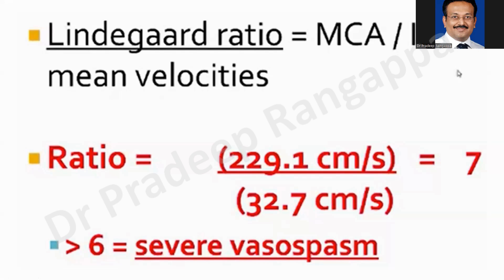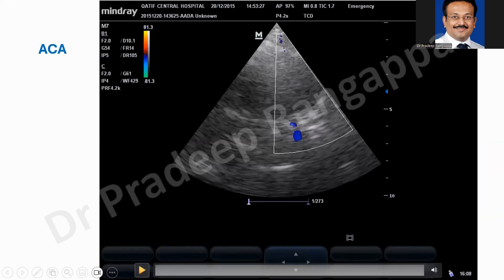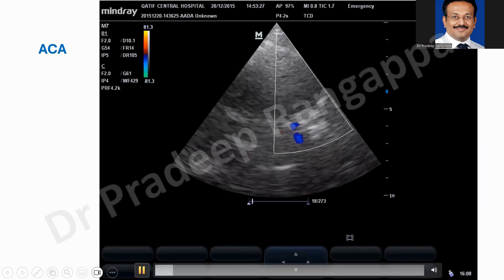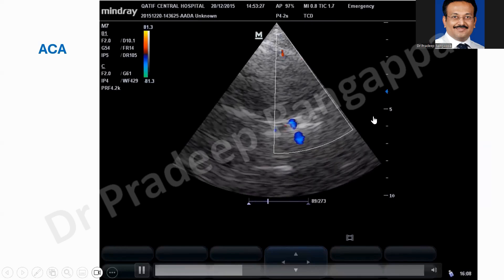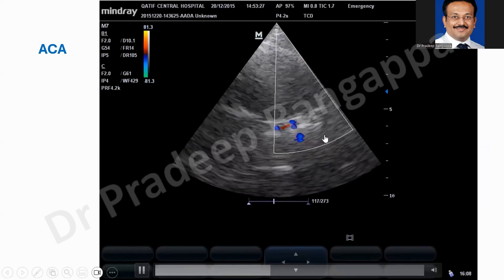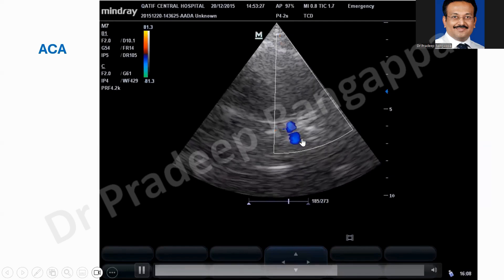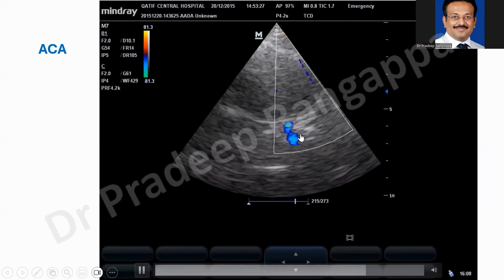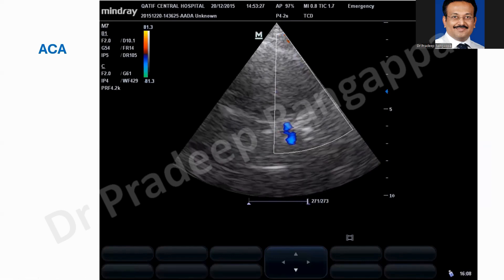There is no huge learning curve for transcranial Doppler — it just needs a little patience and the right steps to pick up these vessels. For the anterior cerebral artery: anything that looks blue is the ACA. It is at a slightly deeper level than the MCA — around 60 to 75 millimeters range, compared to MCA at around 60 millimeters. Place the pulse wave Doppler and check peak systolic velocity and diastolic velocity.